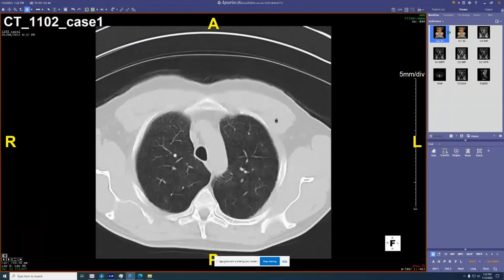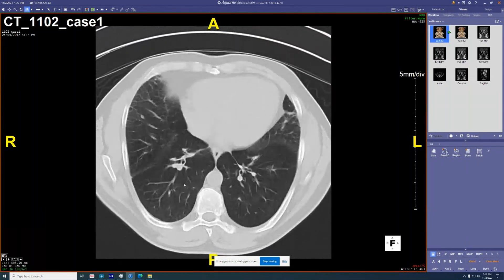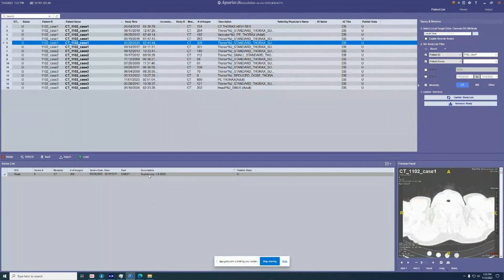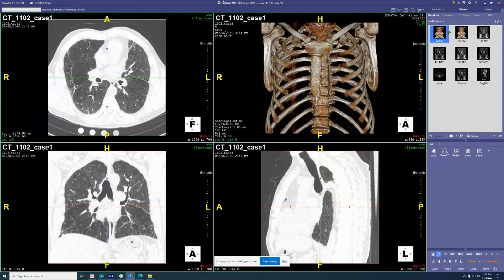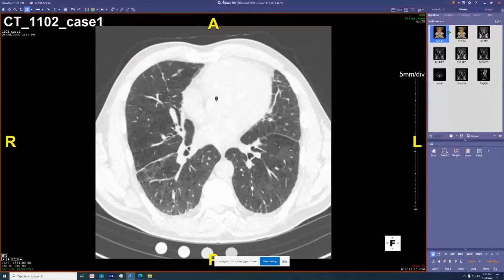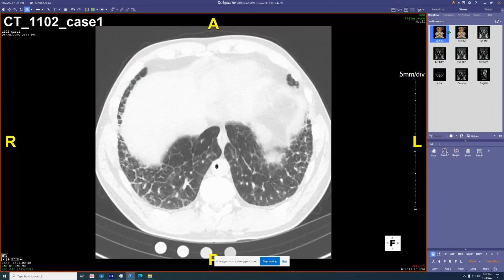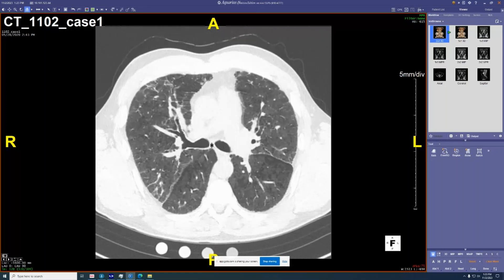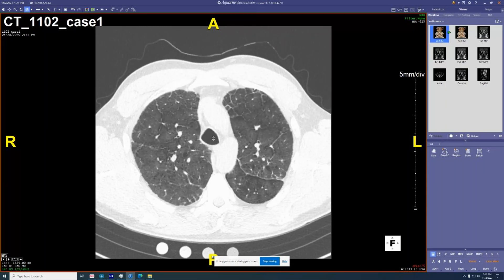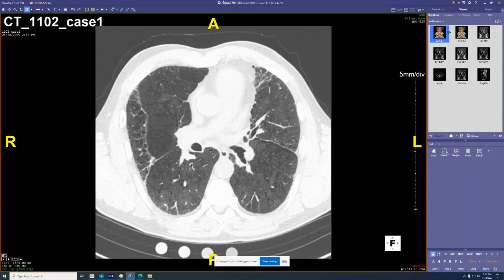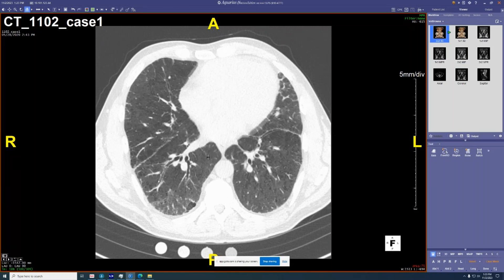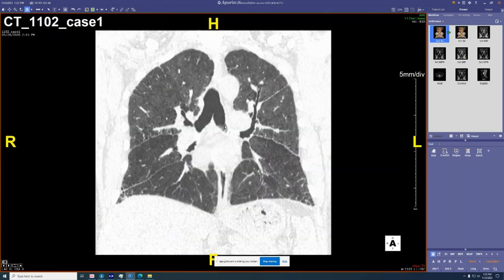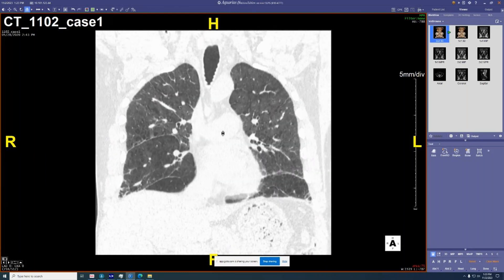The biopsy showed extensive hemosiderin-laden macrophages filling all the alveoli — some sort of chronic recurrent hemorrhage. We've also seen cases of this kind of peribronchovascular lucency in people with chronic hemorrhage. I never previously put this in my differential, but here they say 'oh yeah, we see this.' The septal thickening is a good finding for chronic recurrent hemorrhage. He has no known vasculitis — the biopsy didn't show any sign of vasculitis, just hemorrhage. Just things I'm learning to add to my differential.